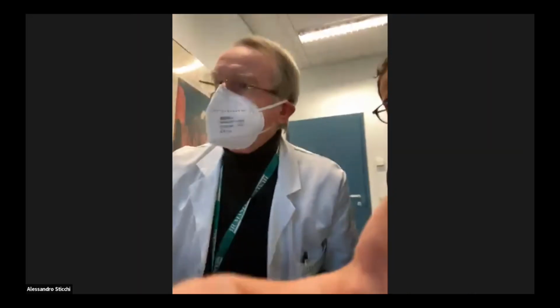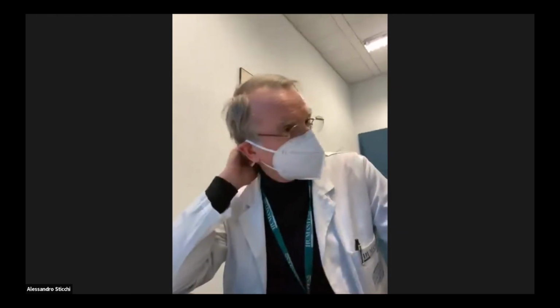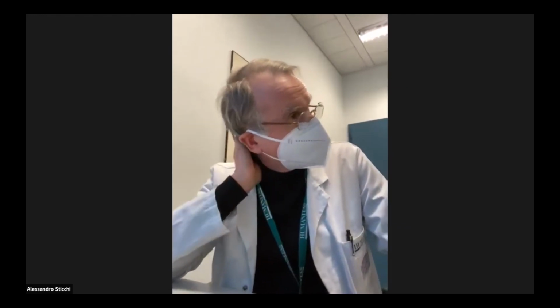With OCT. Yeah, if someone is an expert with OCT, if you see some haziness, you can use it to decide if it's thrombus or residual plaque, and if it's thrombus, you may decide to give some 2B3As, extra heparin, do a low pressure balloon inflation to break the thrombus.